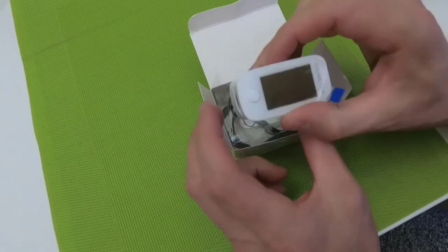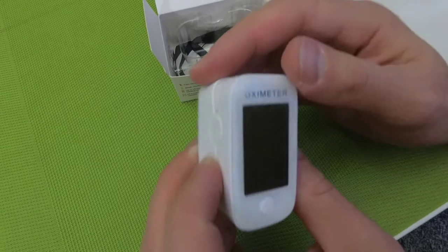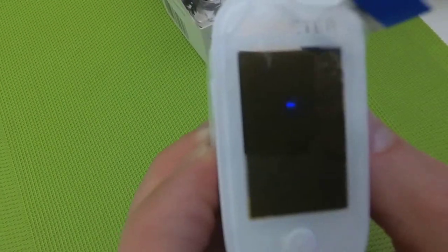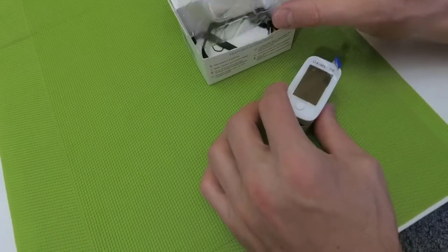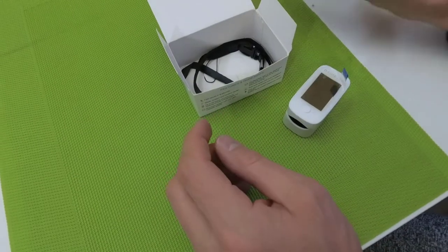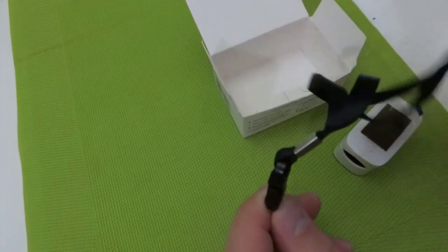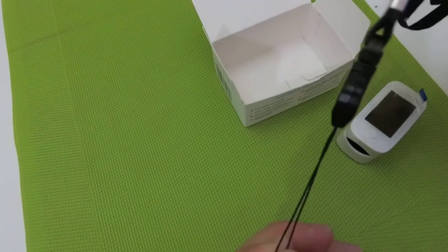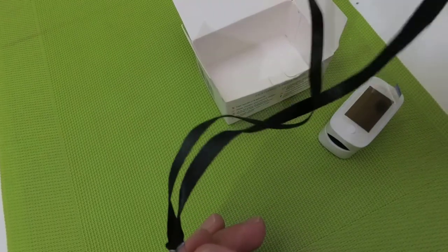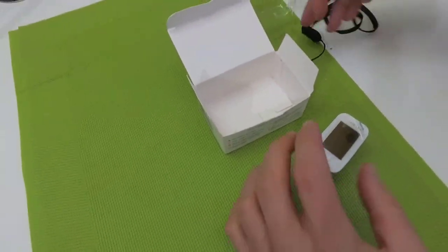We have the device — it's called an oximeter. We also have a box, and inside the box we have a special place for it, as well as a ribbon that helps to keep it fastened. So let's check the device.